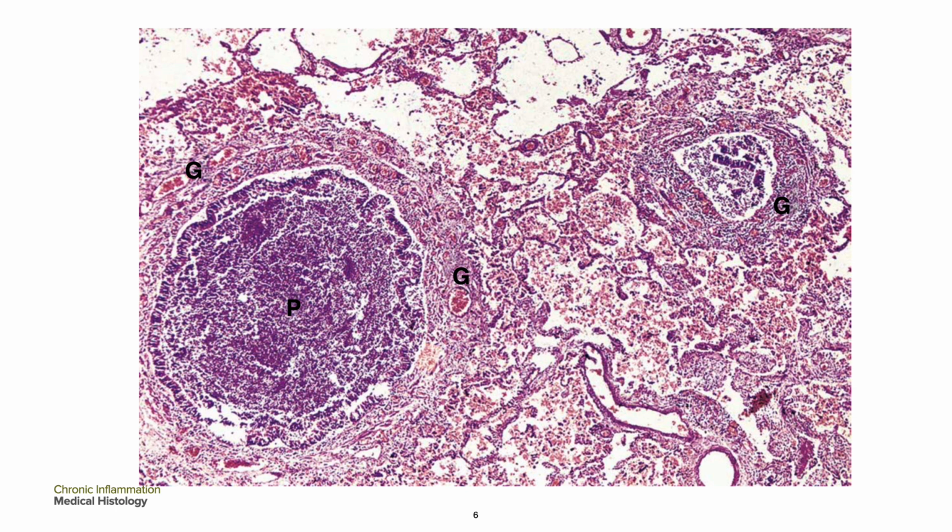In this micrograph, two abnormal bronchi are seen, each with a lumen filled with pus, letter P. The wall of each affected bronchus is formed of fibrovascular granulation tissue, letter G, in which there is a heavy infiltrate of dark staining cells just visible at this magnification. These cells are a mixture of plasma cells and lymphocytes.